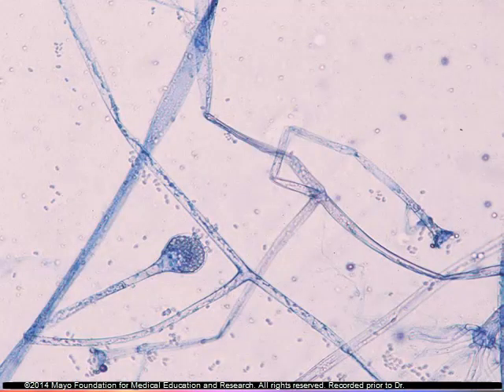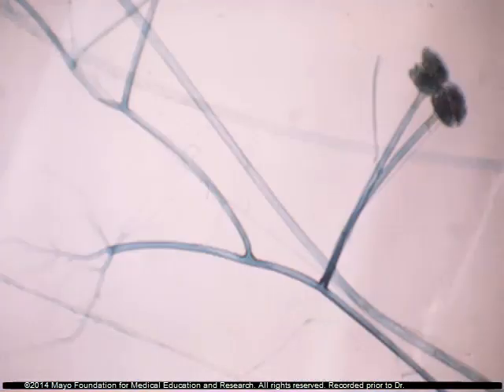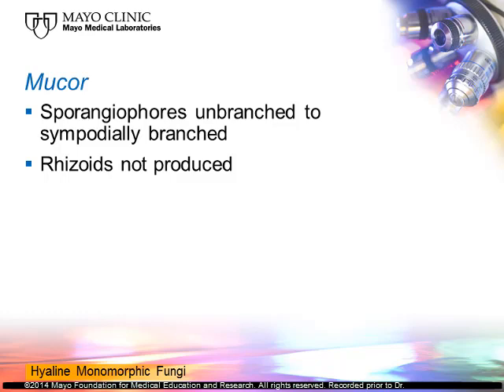Another example, though harder to follow: if you see the sporangiophore in the center and follow it down, there is a septation across it. The stalk continues into a hyphal strand going off to the right, curling around. The rhizoids are off to about 5:30 — still part of that long structure. So the rhizoids are not produced right at the base; they're produced way off to the side. This organism can be hard to identify, but that internodal rhizoid production tells you it is Lichthymia.